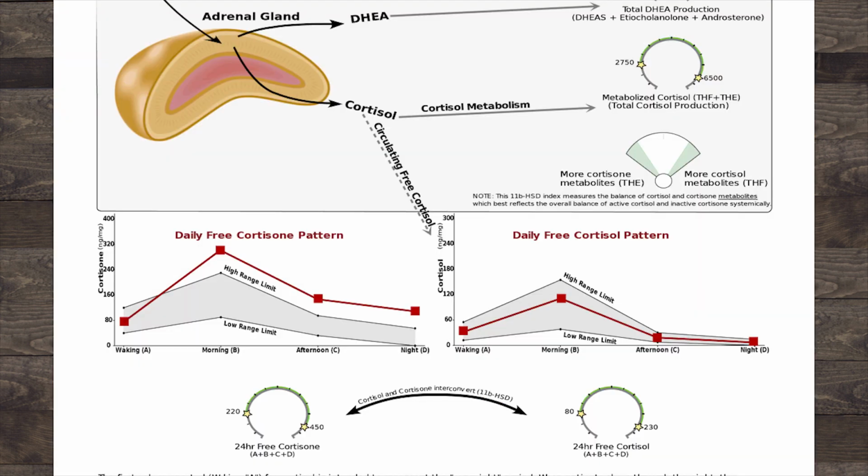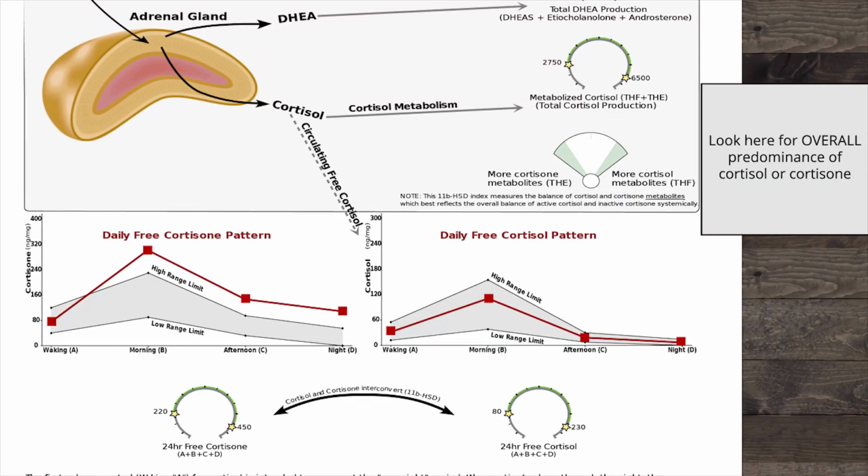So if we look at this particular situation, the cortisol is lower than the cortisone. So we've got a lot of activity in that kidney region that's deactivating the cortisol to cortisone, and then it goes throughout the body. But if we want to know overall which one predominates, we look at the metabolites. So if the metabolites tell that same story and say, yes, there's more of a deactivation to cortisone, then it's a fairly simple interpretation in that overall, we simply have cortisol being shuttled to cortisone.